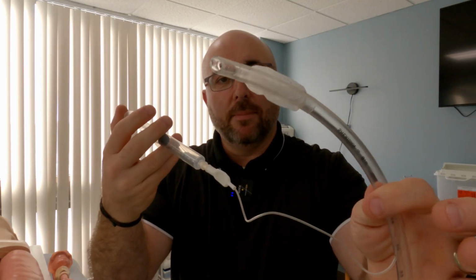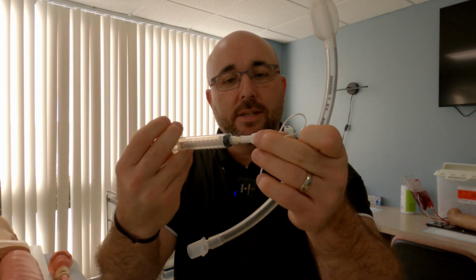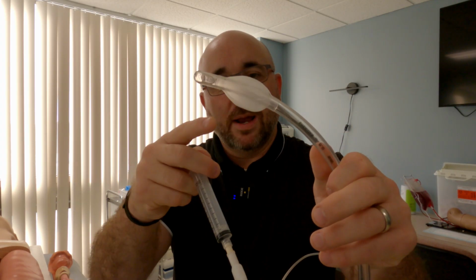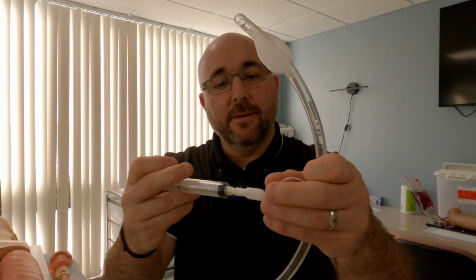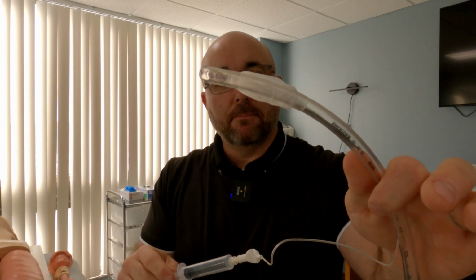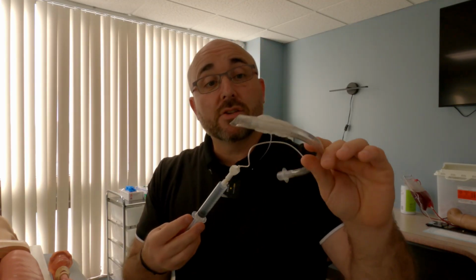And then what I'm going to do is instill 10 mLs of air, and I see that cuff inflate. This is called the pilot balloon. This gives you an idea how much pressure is in the cuff, but it's not perfect. But what I'm going to look for is to see this cuff inflate. Okay, I know that it holds air, and now I'm going to deflate it back, pull it all out, bring it in as close to the tube as I can, so that when we do go to intubate, we can go in.